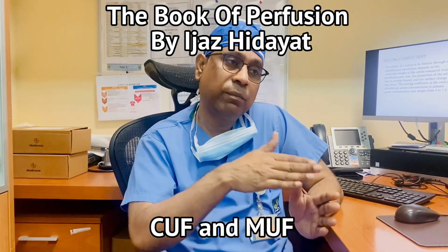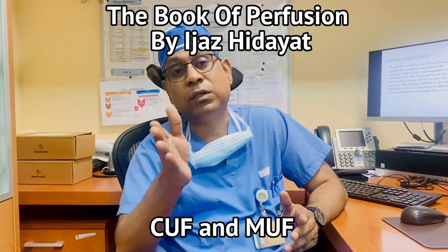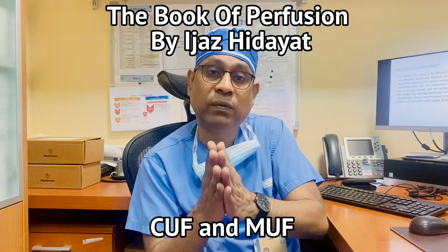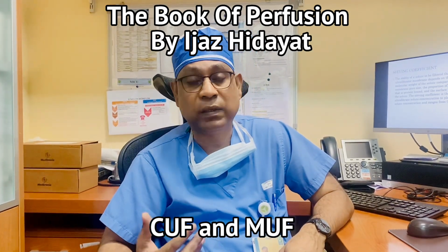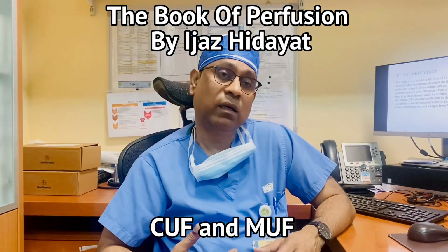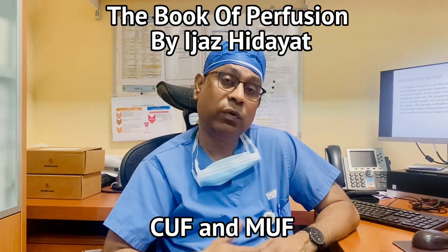After passing through the hemoconcentrator, blood returns back into the reservoir, with the help of the arterial pump. We generate pressure when the pump is running, and we process ultrafiltration and remove plasma water during bypass.